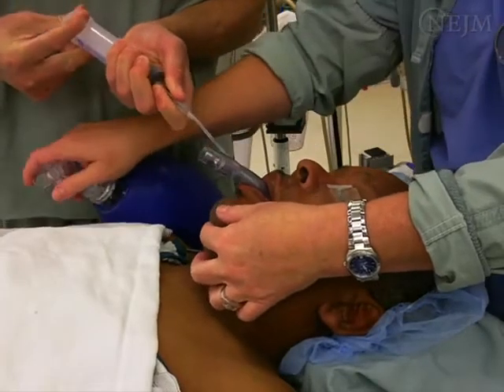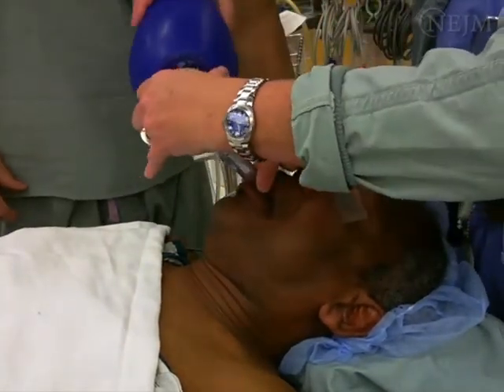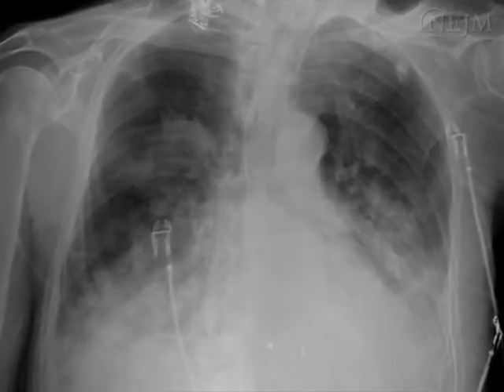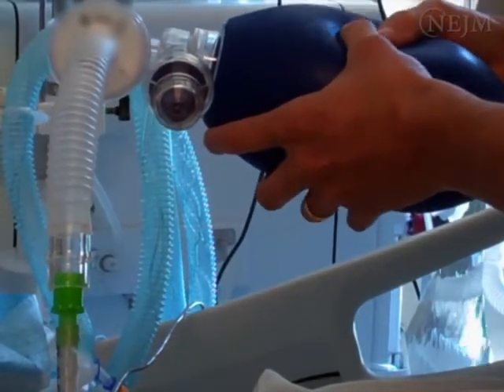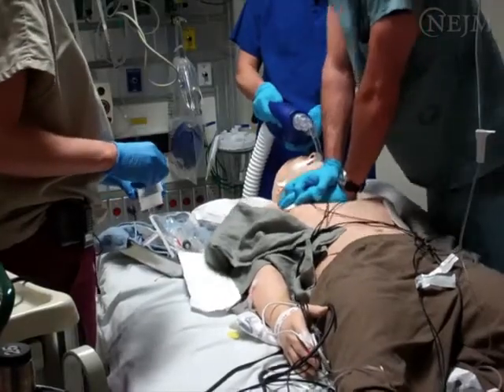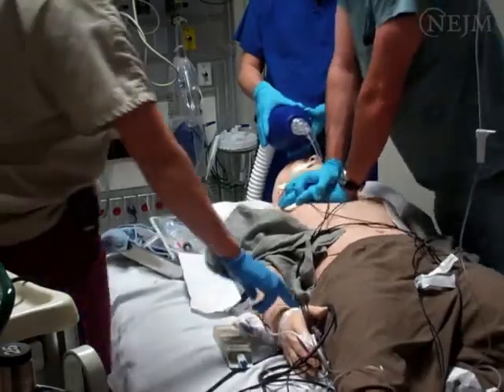Despite its numerous advantages for rescue ventilation, the laryngeal mask airway does not provide a secure airway and will not protect against aspiration when the volume of gastric contents is large. It may also be difficult to ventilate a patient with a laryngeal mask airway when high airway or thoracic pressures are encountered, for example during vigorous chest compressions, or in obese patients, or patients with parenchymal lung disease.